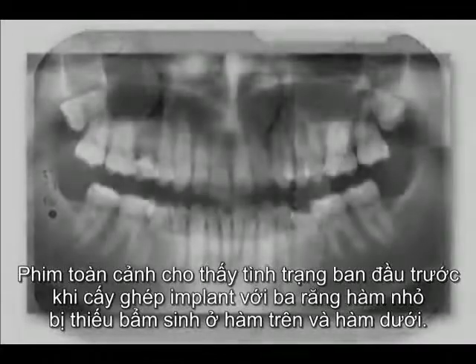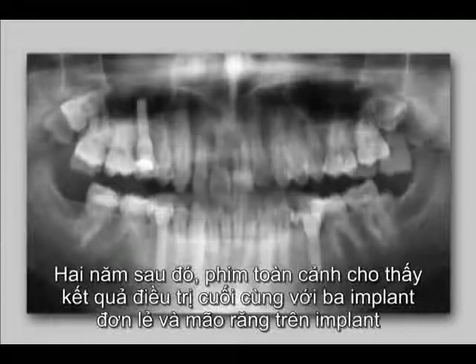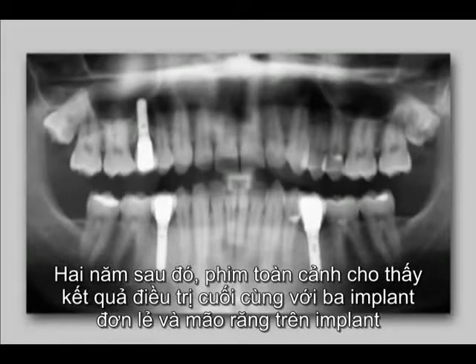The panoramic radiograph shows the original situation at the beginning of implant therapy with 3 congenitally missing premolars in the maxilla and mandible. 2 years later, the panoramic radiograph illustrates the final treatment with 3 single-standing implants and implant-supported crowns.